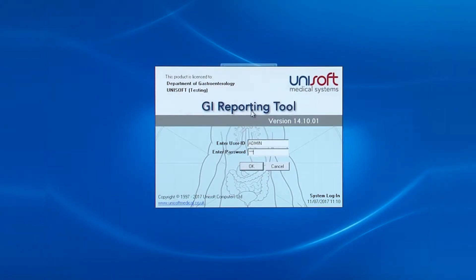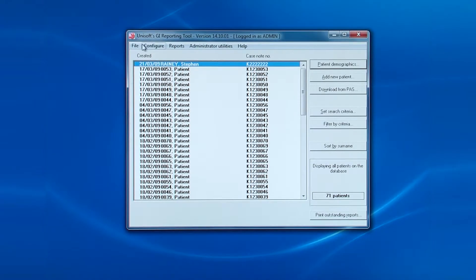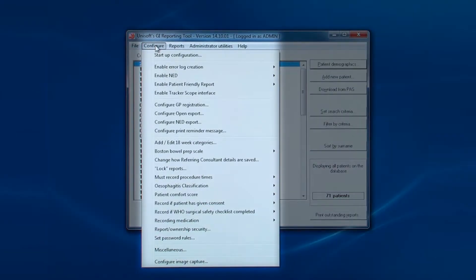When admin logs into the software, these are the options that appear under the configure menu. This is showing version 14 of the software, the NED compliant release. Previous versions will have the same options but they are shown in a different order.